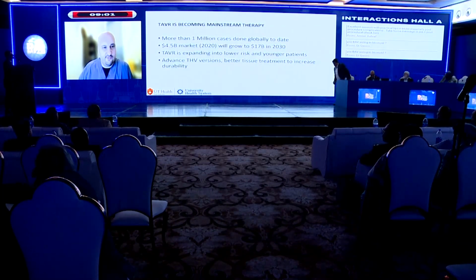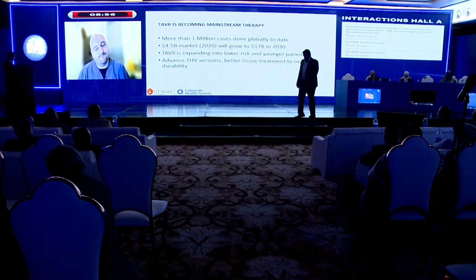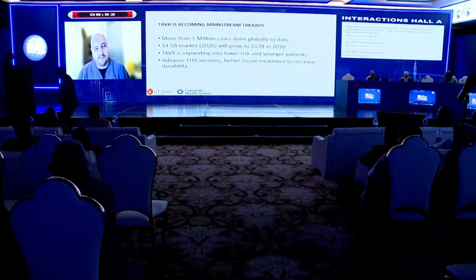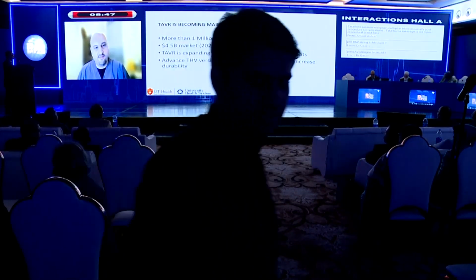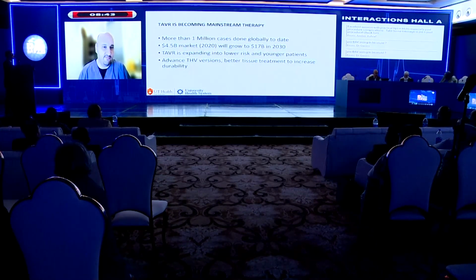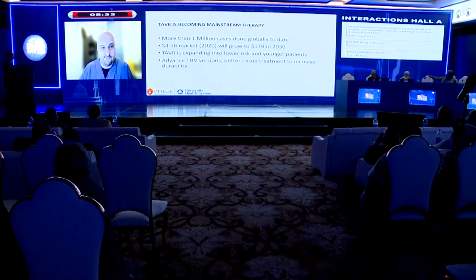As you know, in 2015, the number of TAVRs done was more than the number of isolated AVRs. And then in 2018, it even crossed all surgical aortic valve replacement, becoming the most common therapy for aortic valve replacement in severe aortic stenosis patients. And it's expanding into lower risk populations, and there's a lot of improvement coming into TAVR in terms of design and work on leaflet technology, which we're going to briefly touch on.